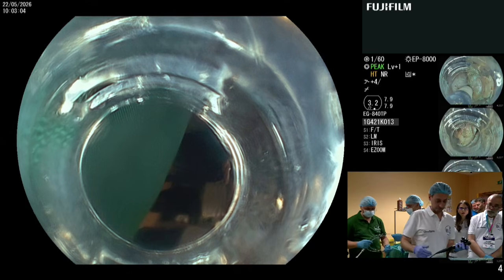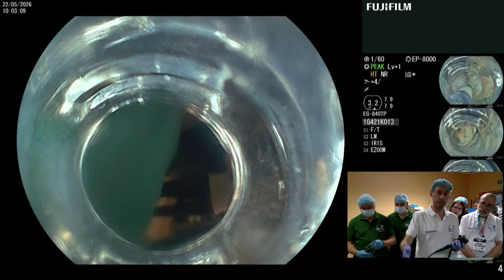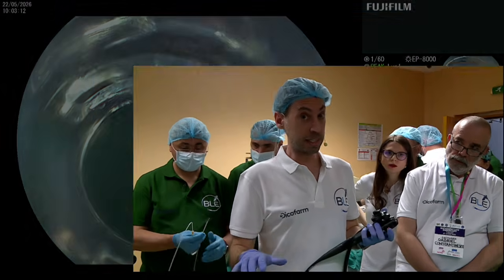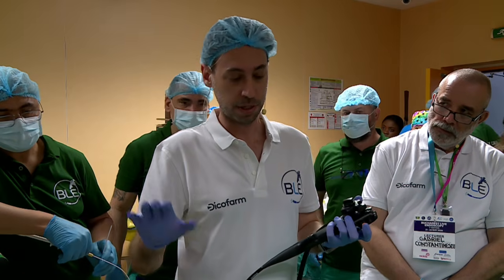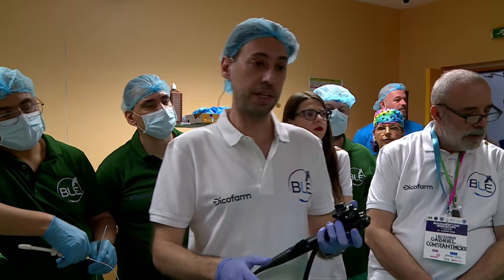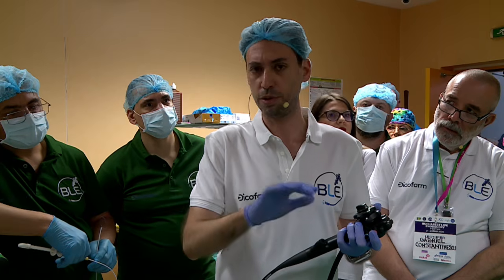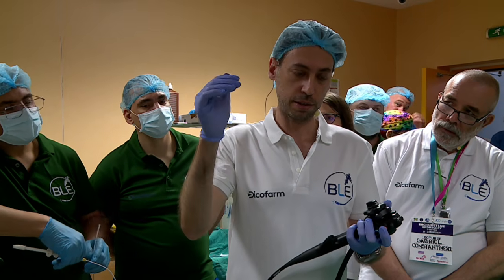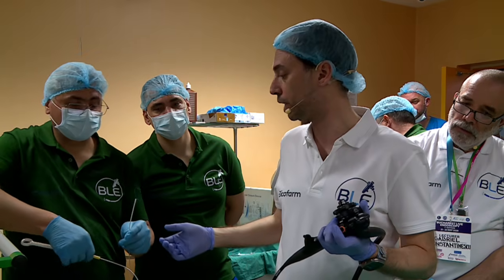Now, what are the next steps? The next step is to puncture the abdomen in order to relieve the pain that the patient will have after the procedure. The patient will not eat anything, and tomorrow morning we will do a CT scan without anything, no contrast, no nothing. The role of the CT scan is to identify where the artifacts of the clips are located in the abdomen. Then we will give 4 glasses of water with contrast to the patient, no intravenous contrast, and he will drink them, and after 30 minutes we will do a new CT scan. This is the leakage test. This is the best way to identify whether there is an ongoing leak.